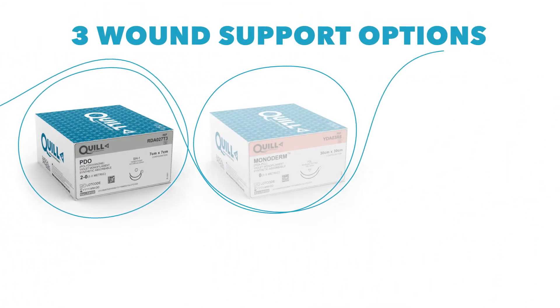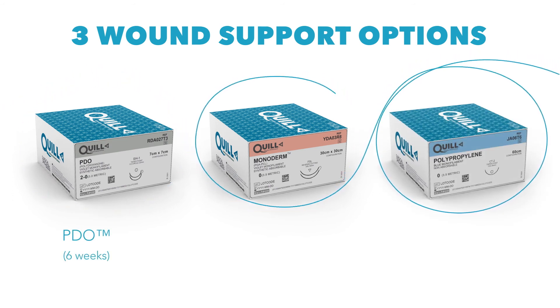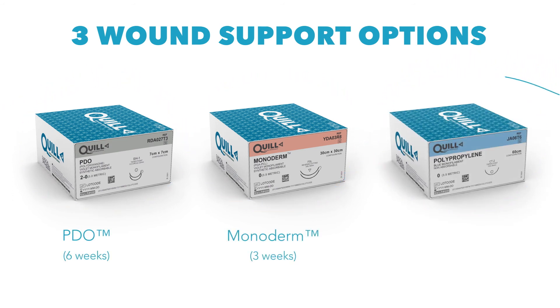Quill Veterinary Sutures come in three materials commonly used in veterinary medicine: PDO for six-week wound support, Monoderm for three-week wound support, and Polypropylene for permanent placement in tissue. The strength and absorption times are predictable and stable as well.